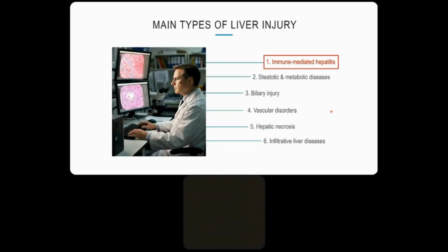So as you may have suspected, the diagnosis here is that of a severe immune-mediated hepatitis. And in this clinical context, the biopsy findings are consistent with autoimmune hepatitis. The overall amount of fibrosis was actually mild on the biopsy, indicating that the FibroScan measurements were likely confounded or inflated by active inflammation around the time of biopsy.